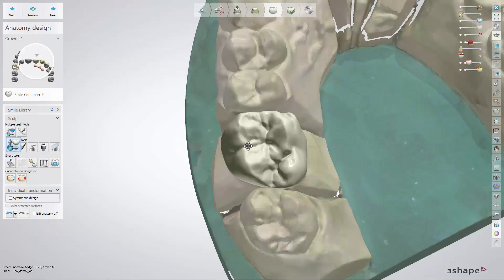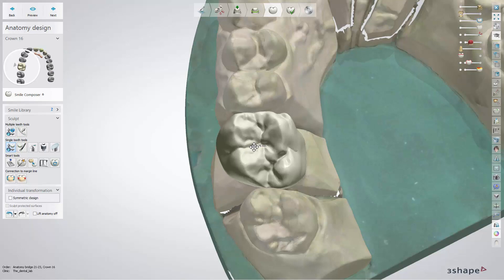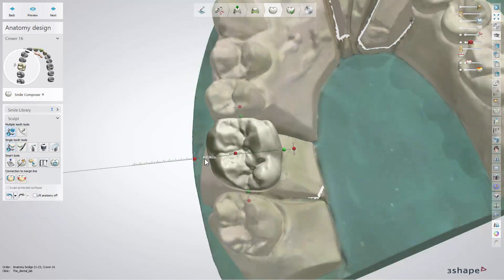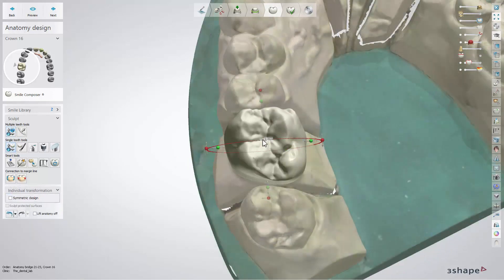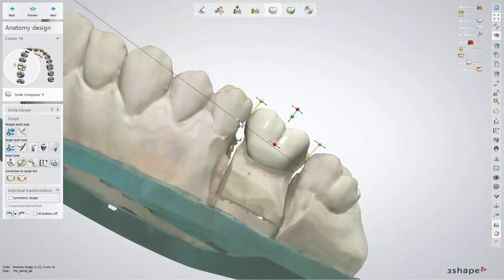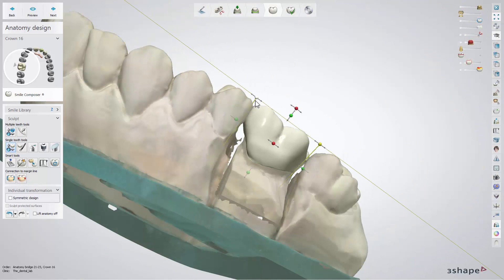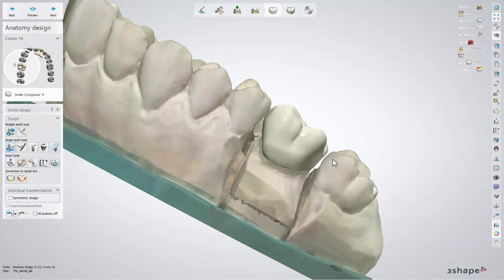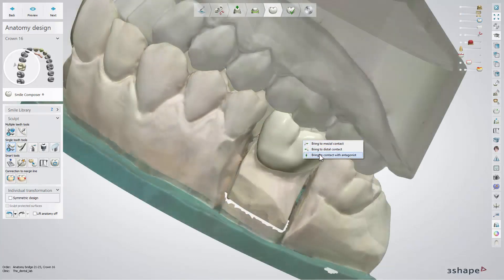The Individual Transformation tool can be used both for a single restoration and a single tooth in a multiple teeth restoration. This tool allows you to move the design, scale and rotate it using points on the design. The view of all points changes depending on the view direction. Right click on a tooth to display options that allow you to move the design to mesial or distal contact and into contact with the antagonist.